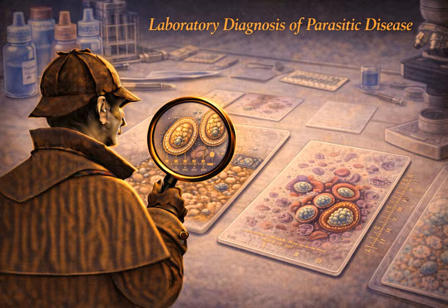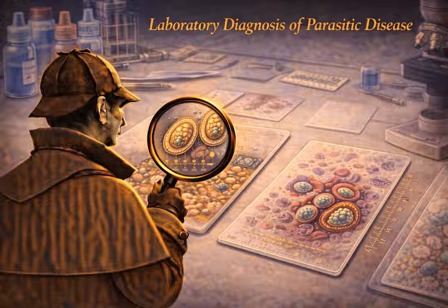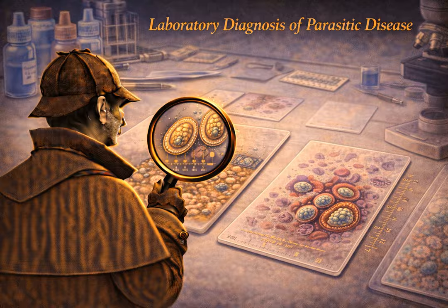Let's clearly define that for the listeners. Trophozoite. It comes from the Greek root troph, meaning to feed or nourish. Trophozoites are the active, feeding, multiplying, motile stage of the protozoa, and they are incredibly delicate. They're basically just a fragile cell membrane holding some cytoplasm together. If they cool down to room temperature, or if they dry out even slightly, they die. Or they do what we call round up. Round up. Yes, within 30 minutes of leaving the body, they lose their distinct shapes and just become generic circular blobs. And once they round up, you absolutely cannot identify them.